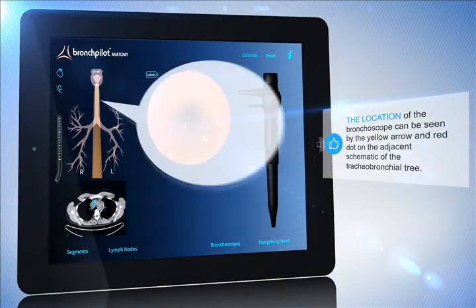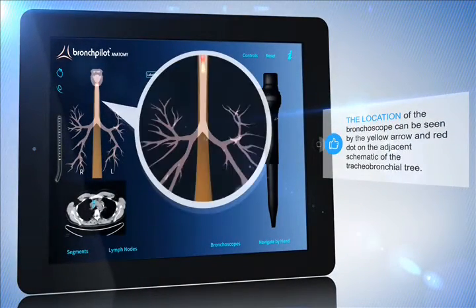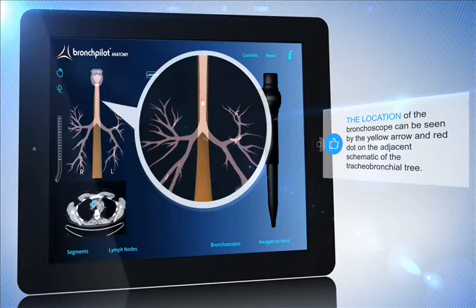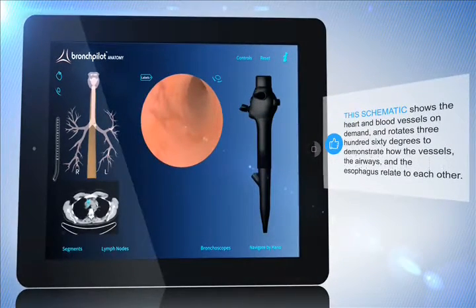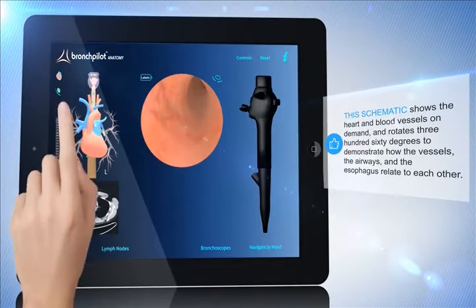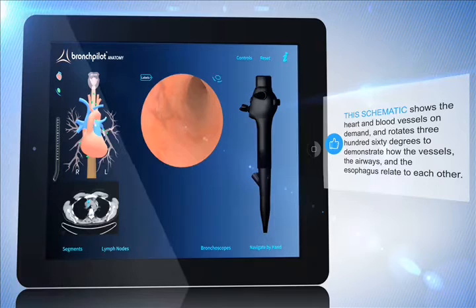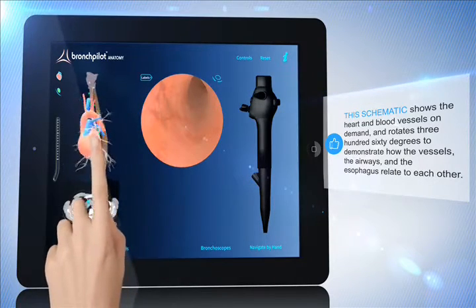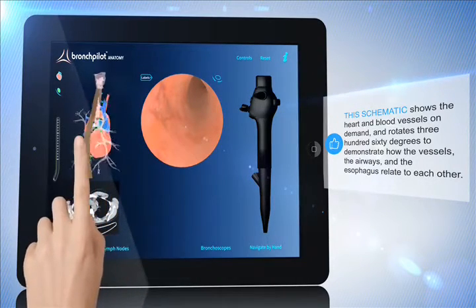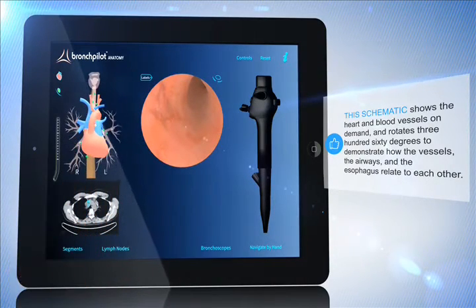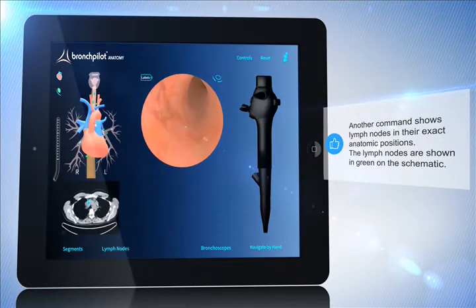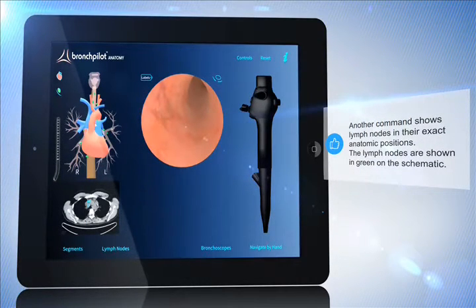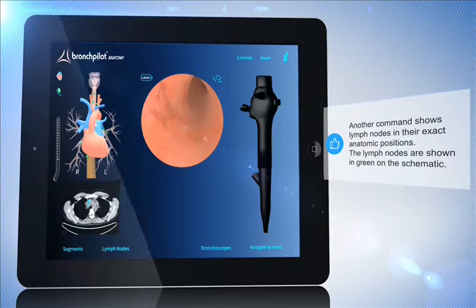The location of the bronchoscope can be seen by the yellow arrow and red dot on the adjacent schematic of the tracheobronchial tree. This schematic shows the heart and blood vessels on demand and rotates 360 degrees to demonstrate how the vessels, the airways, and the esophagus relate to each other. Another command shows lymph nodes in their exact anatomic positions; the lymph nodes are shown in green on the schematic.